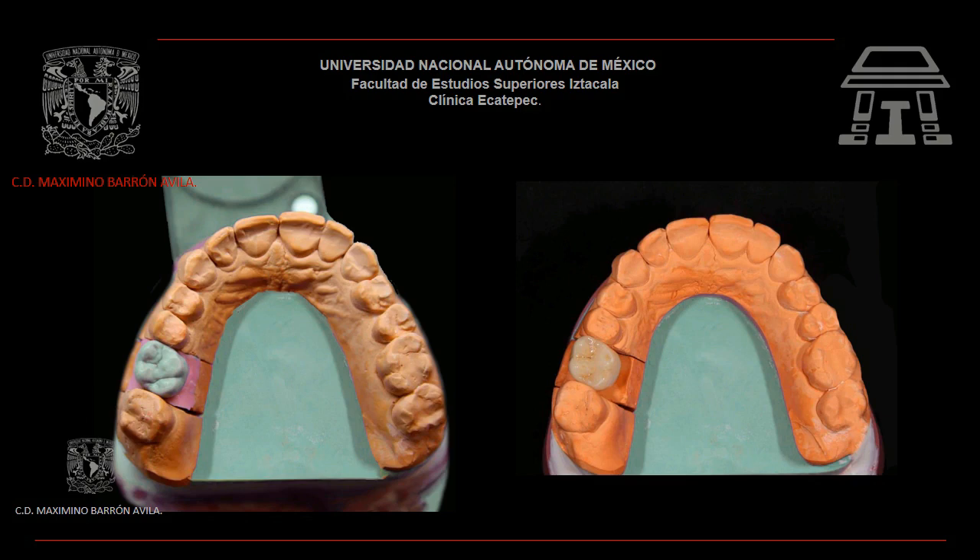El troquel es un modelo individual del diente preparado donde se modelan y terminan los márgenes de las restauraciones protésicas indirectas.